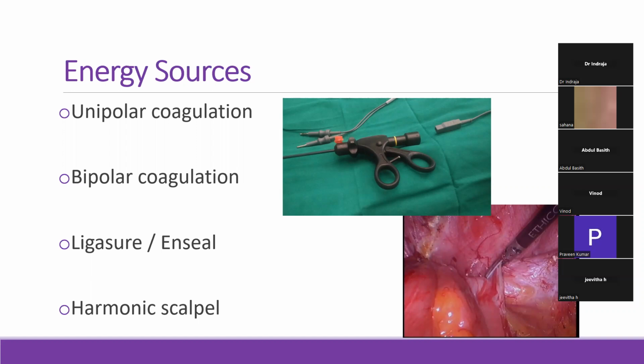No. Not all vessel sealers are cutters. They incorporate a little knife in it, and that causes the cutting. But in the actual process of coagulation, what's the difference between a vessel sealer and a bipolar?